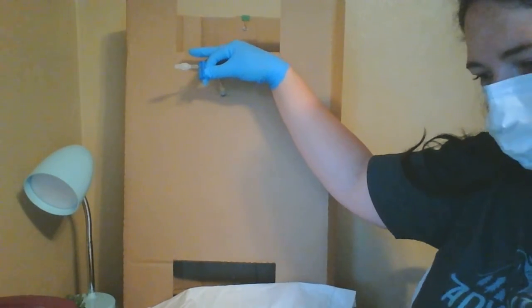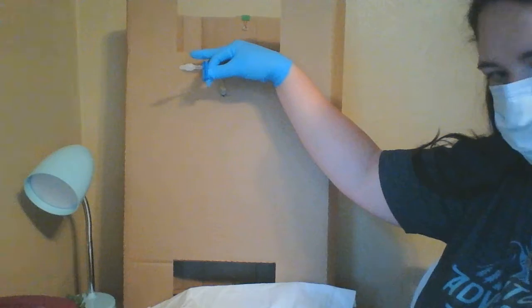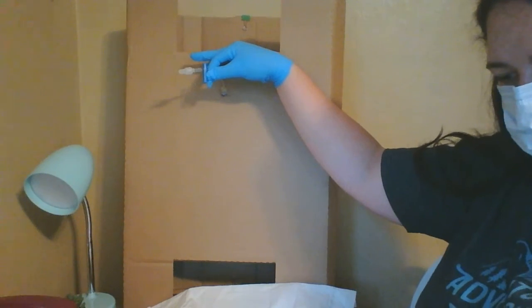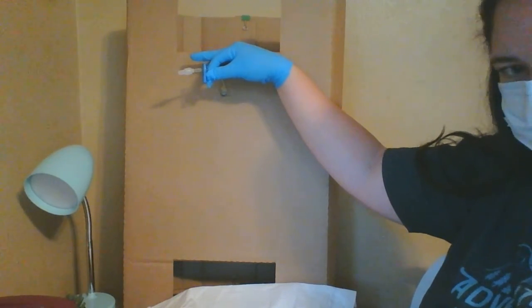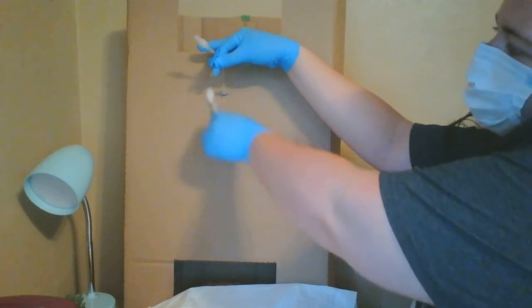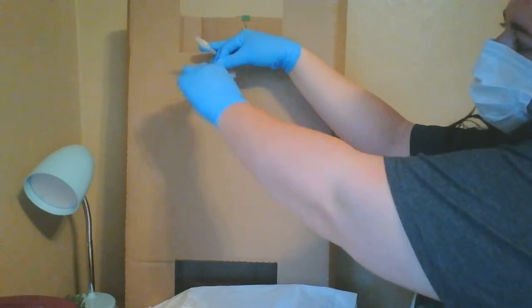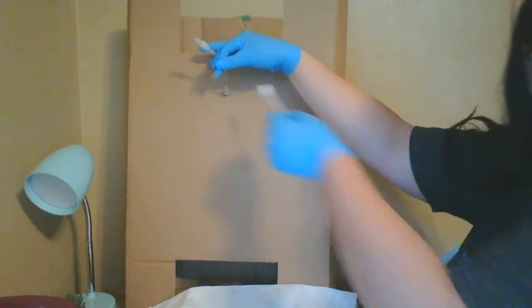And then now we can do our swab. So, and then you would just do the same thing, clean out the base, and then up on the tubing, and throw it in the vial.